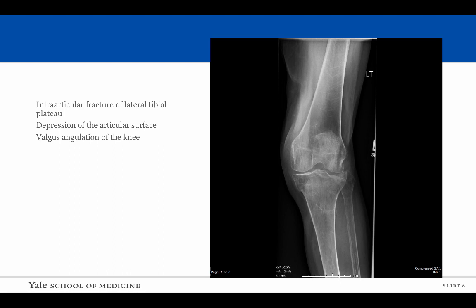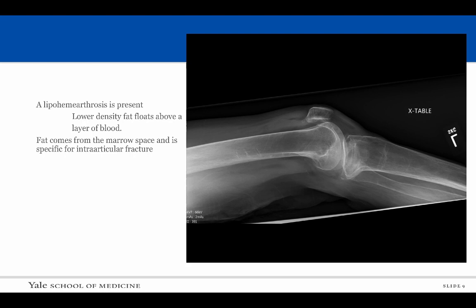This patient sustained a traumatic injury to the knee. There is an intraarticular fracture of the lateral tibial plateau with depression of the articular surface. There also is valgus angulation of the knee, which is the angle formed by a line drawn through the long axis of the femur and the long axis of the tibia. On the cross table lateral view, we can see a lipohemarthrosis is present. The lower density fat appears darker than the higher density blood products and rises to the top much like oil does with vinegar. When liquid fat is present in the joint space, this is a good sign that there is an intraarticular fracture.